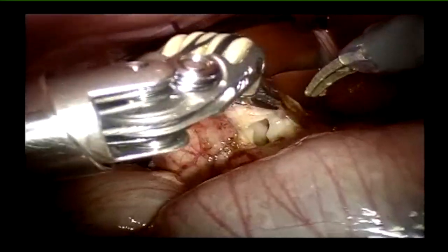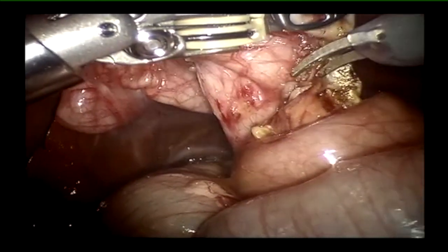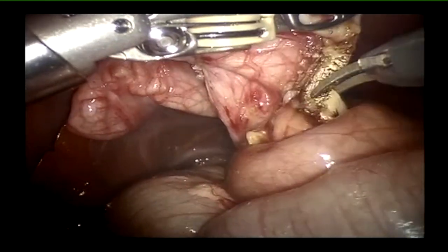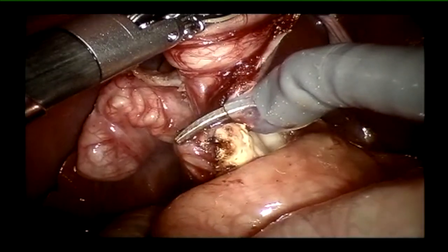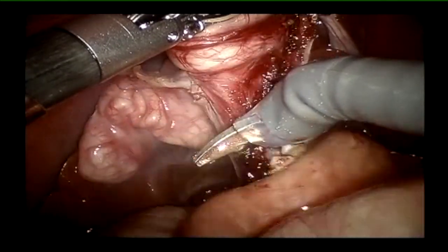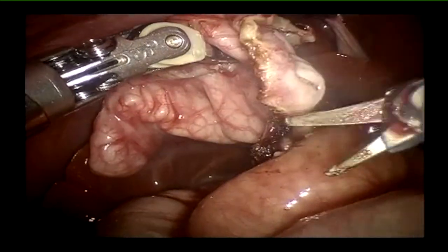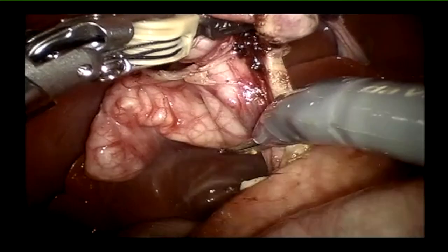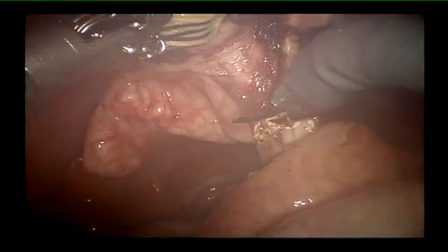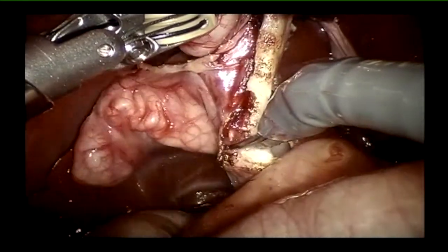This is a very large cyst — difficult to navigate around. Rather than guesswork, we go right up to the margin of the pancreas, which you can see just below my scissors — that yellowish structure. We have reached what we call the retroduodenal part and now start dissecting from inside as well as outside. This technique of opening the cyst and dissecting from both sides allows more precise dissection without damage to surrounding structures.